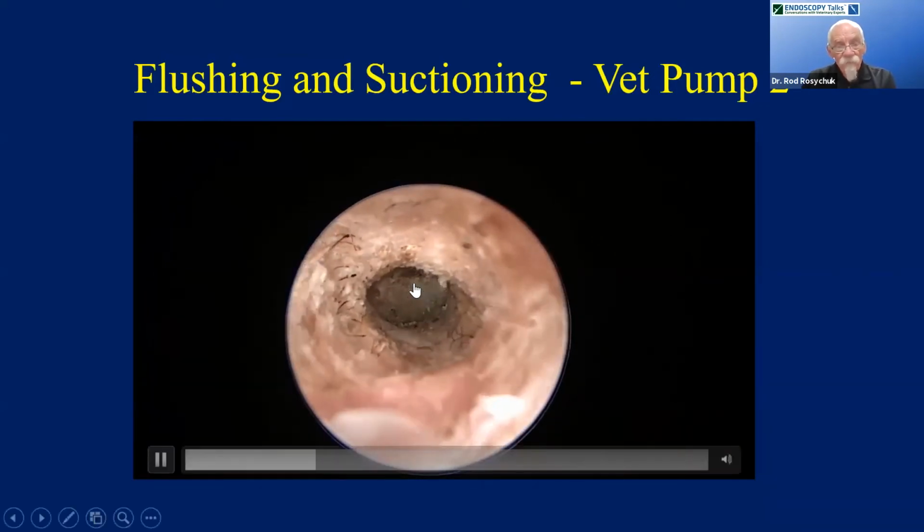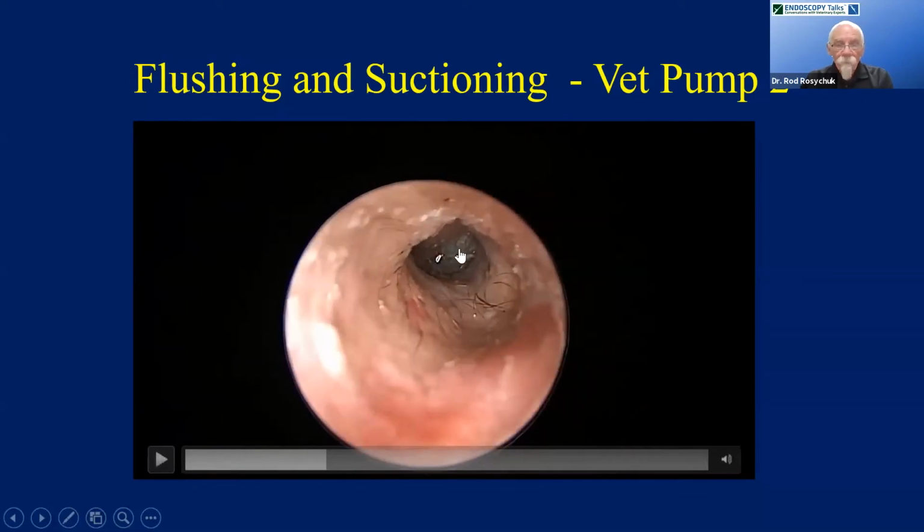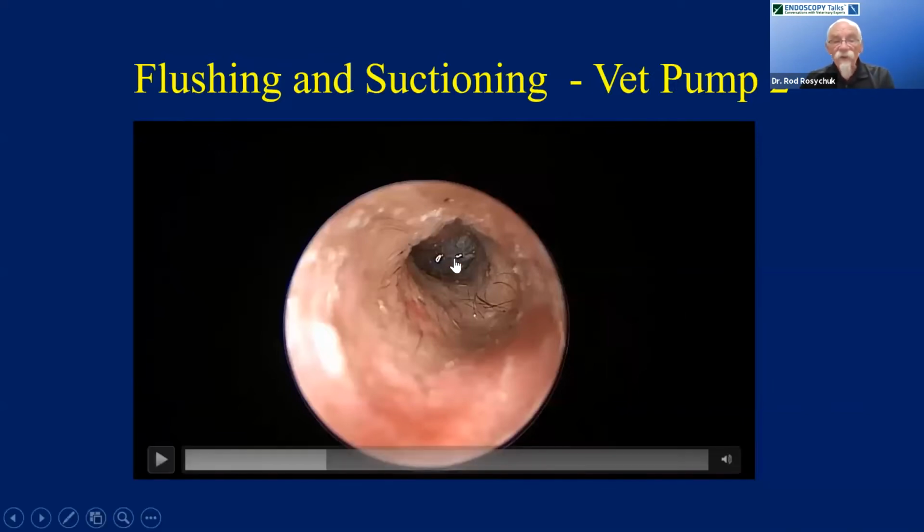Here we have a pathologic tympanum, more opaque than it should be because material has been sitting on its surface, so it's irritated and thickened. That's the pars flaccida up here. Very nicely cleaned ear.